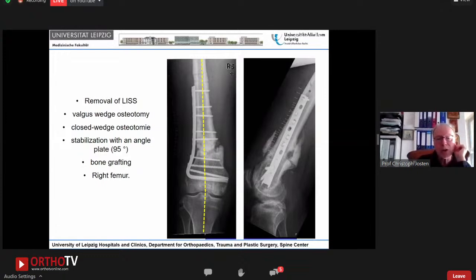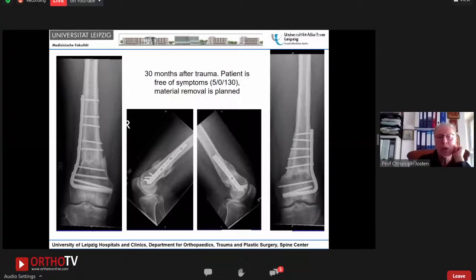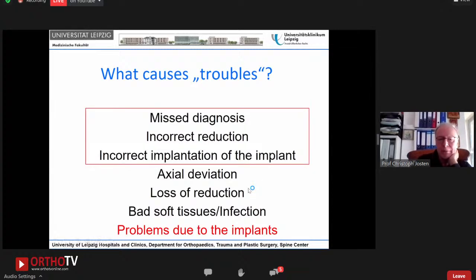We made a valgus wedge osteotomy. That means a closed wedge osteotomy, a 95-degree angle plate, and a bone grafting on the right femur. And this is on the other side. And you see 2.5 years after correction osteosynthesis on both sides, it's a good healing, and you can remove the implants. And you see, if you use a good implant and a stable implant, sometimes the old horses are riding very well. And you see, this is a classical plate, a cheap plate, but a stable osteosynthesis, and you don't need any medial support, and you could get a good healing.